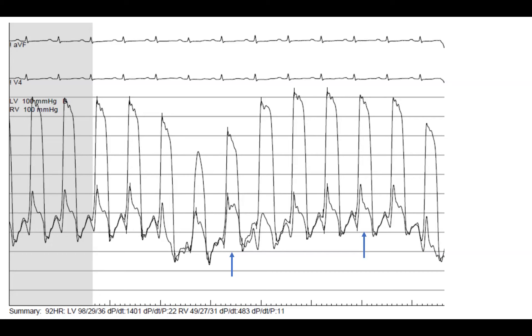Another thing I want to highlight is diastolic equalization — the second feature you look at on this tracing. Diastolic equalization means that in end-diastole, the RV and LV are superimposed. They don't superimpose throughout the cardiac cycle; they typically superimpose at one portion. Here they are superimposing in inspiration, then the LV becomes bigger than the RV in expiration — they separate, but are equal in inspiration.